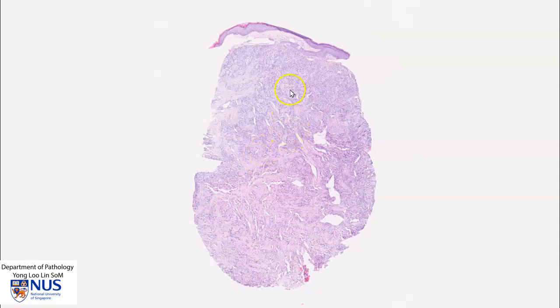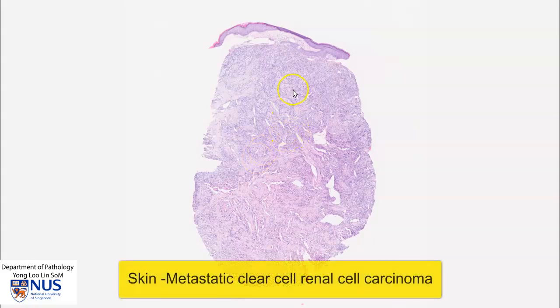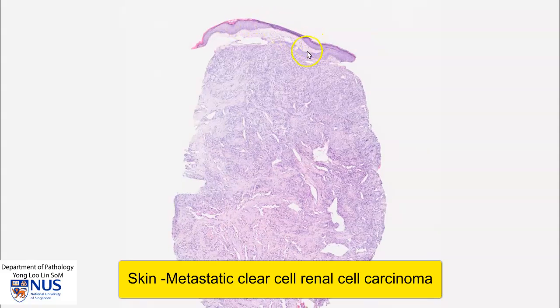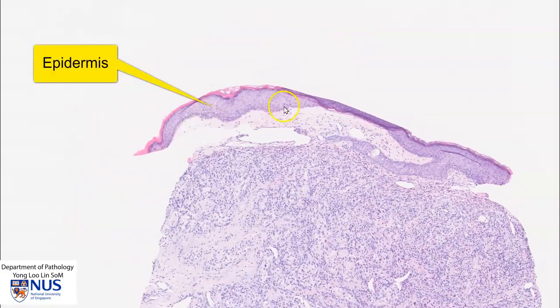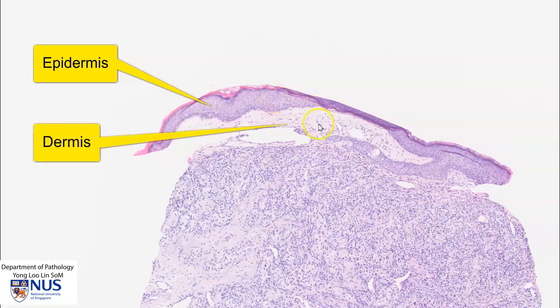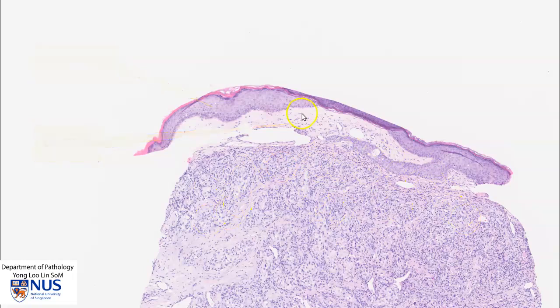Hello, this is a virtual microscopy slide of metastatic renal cell carcinoma to the skin. Let's first orientate ourselves. Here we can see the epidermis, which is composed of stratified squamous epithelium, and below this is the dermis, and this whole area is the tumor deposit.